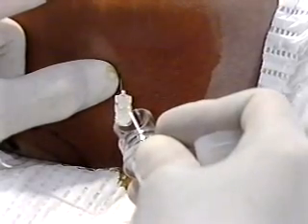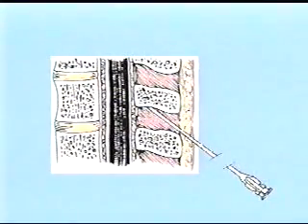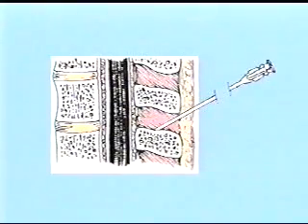The correct position for needle insertion is directly between the vertebrae. If resistance is met, withdraw the needle slightly and redirect it or reposition the infant. The practitioner has most likely directed the spinal needle either too far cephalad or too far caudally, so that the needle is coming in contact with the vertebra. This may also result if the infant is not restrained properly, causing rotation of the spine. This is a frequent problem with large neonates.